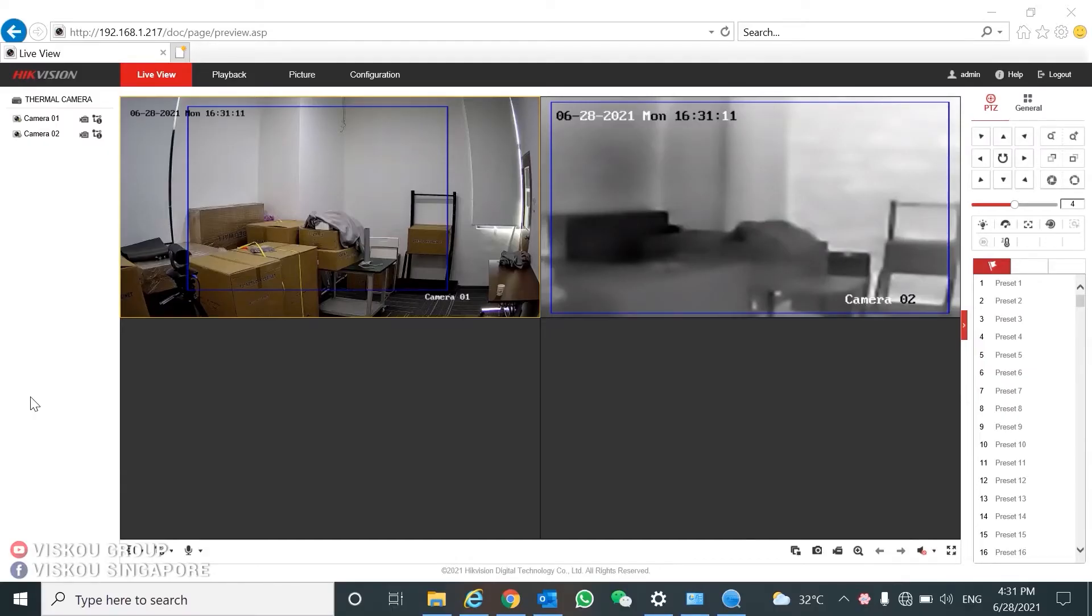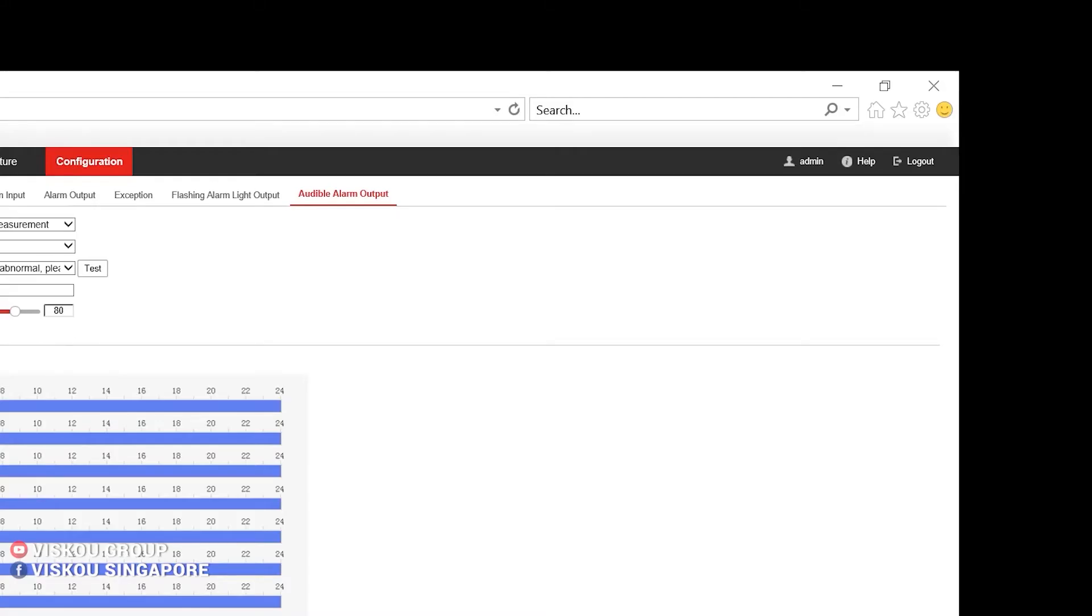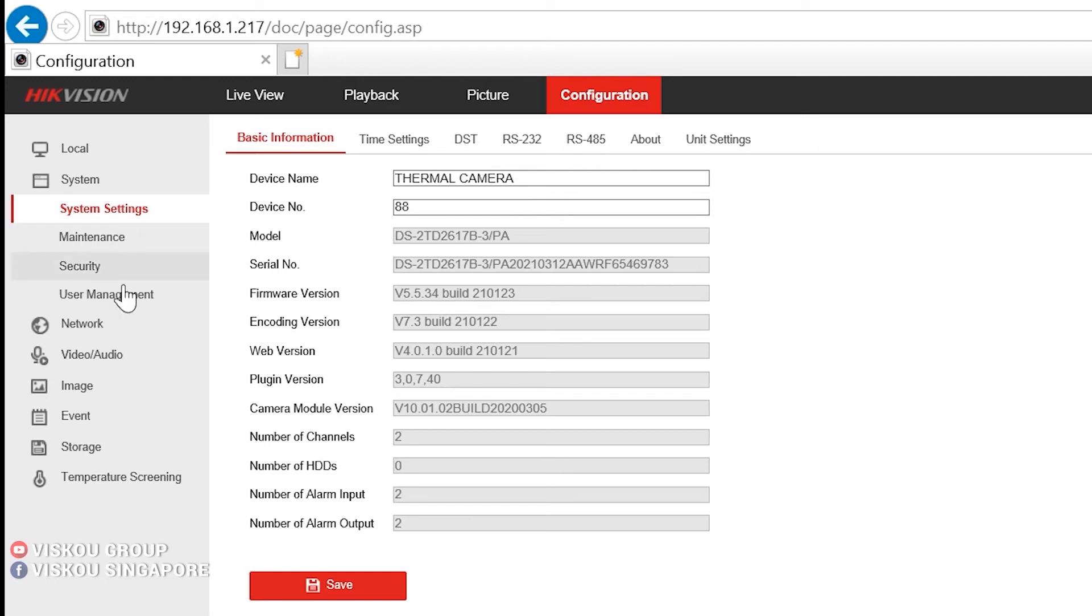So now we are going to start our configuration part, how to do it. We will go to the configurations after we log into the IP configuration. You can go onto the system and check it. So this is the model number. Just now I said the 2617B, the temperature screening bullet camera of head visions.